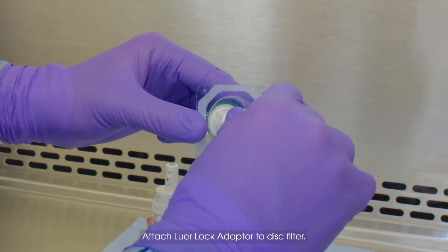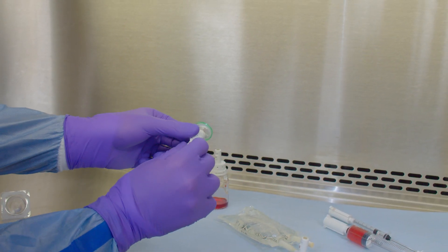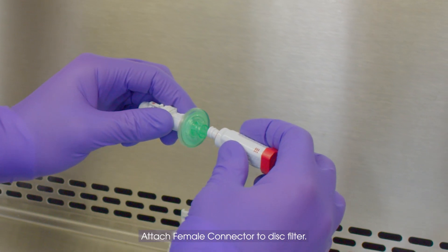Attach Luer Lock Adapter to Disk Filter. Attach Female Connector to Disk Filter.